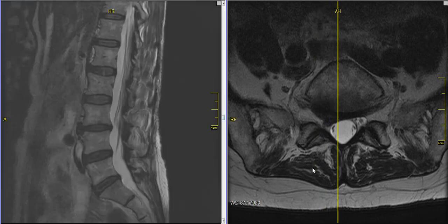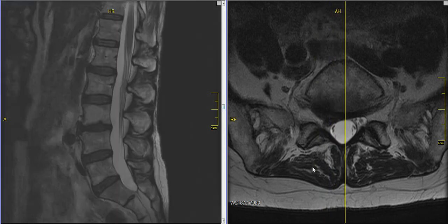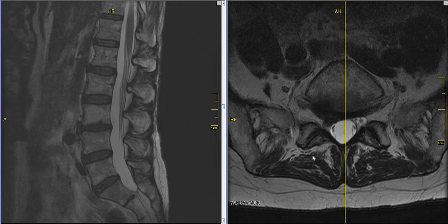So this is a herniated disc. It's a fairly common thing, treated in various ways, and it can sometimes resolve on its own — in fact, often does.